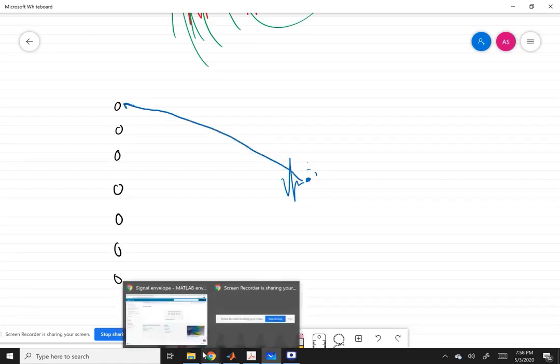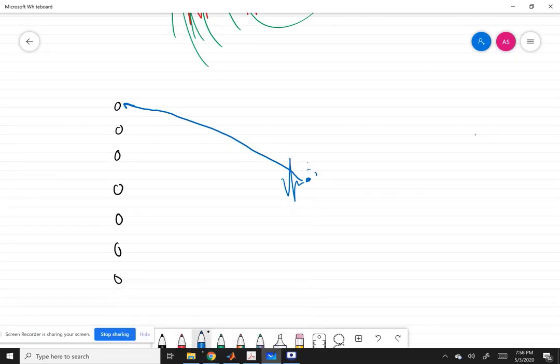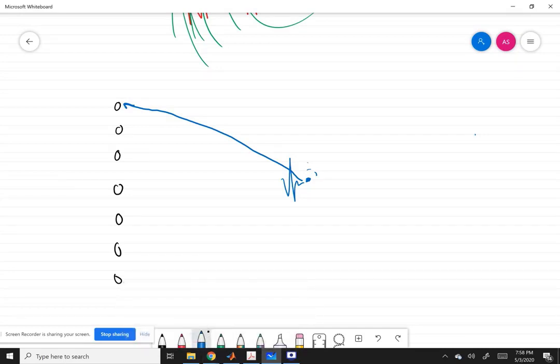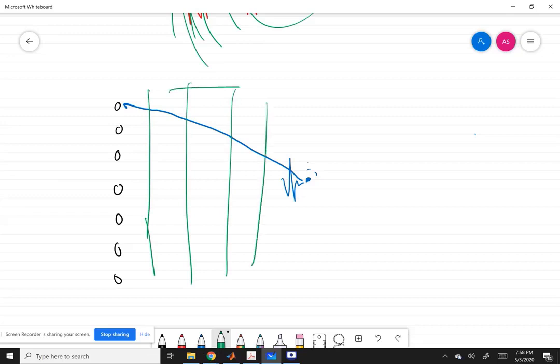Okay, so for the onward transmission, that is from the transducer to the object, we can assume as if a single plane wave was transmitted in the forward path. Okay, so the total path from the transducer till the object, the distance is, say, d.